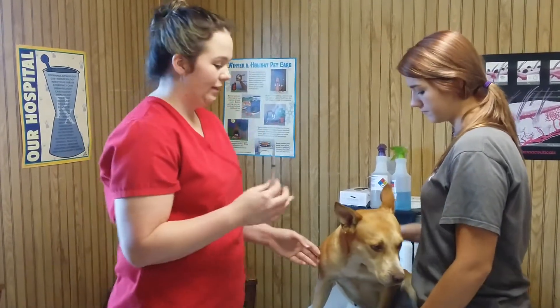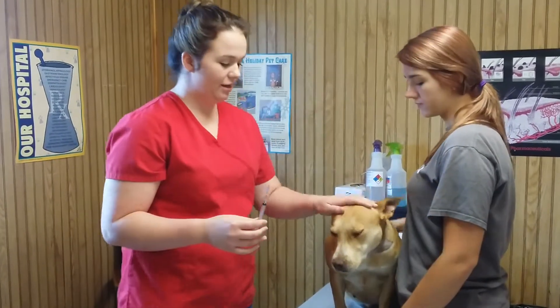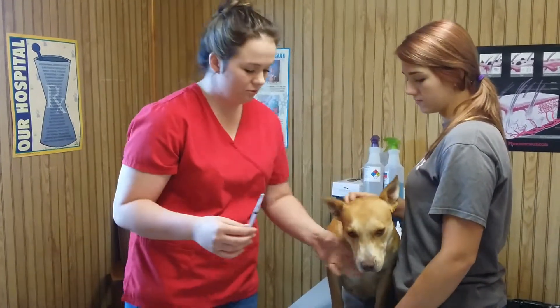My name is Hallie Chilgo and I will be performing a jugular vein puncture today. This is Jackie, and Hattie is my holder.